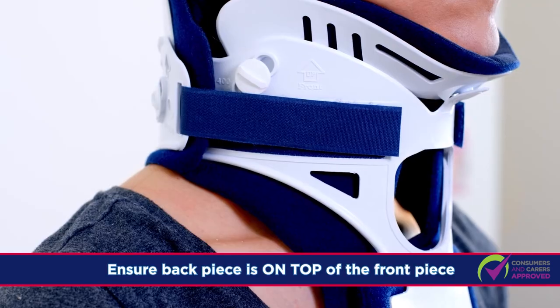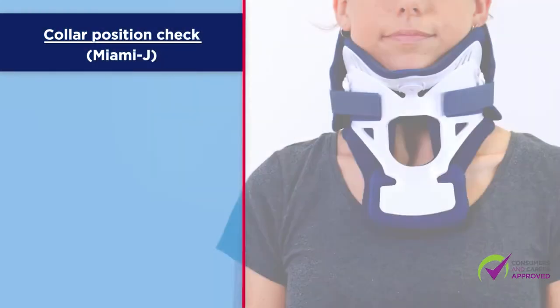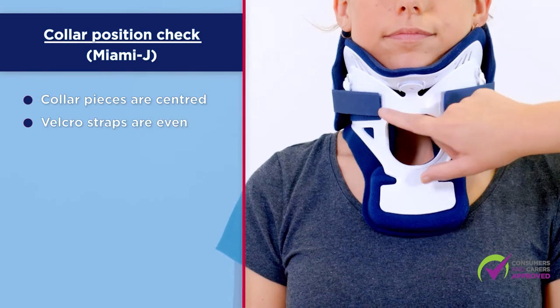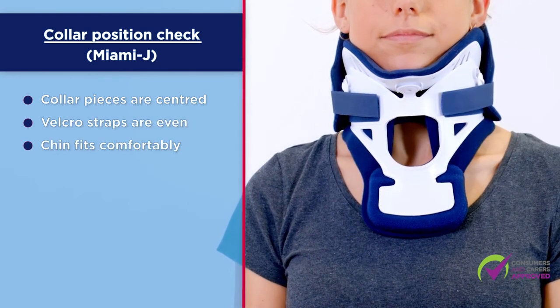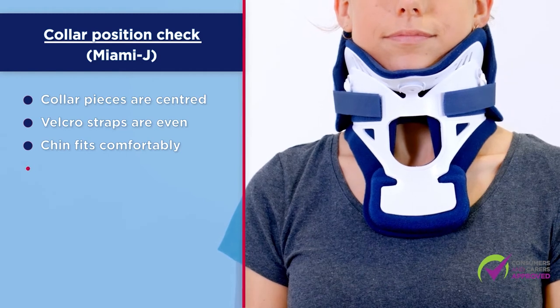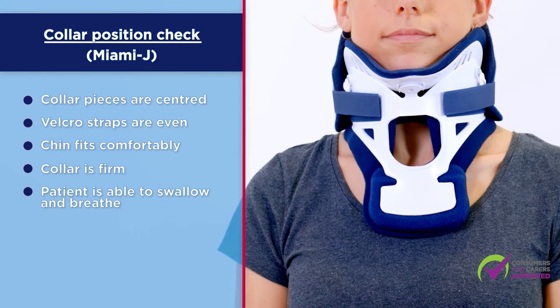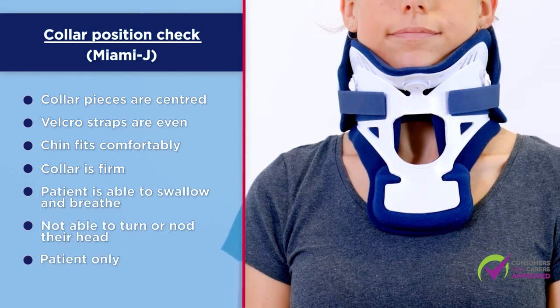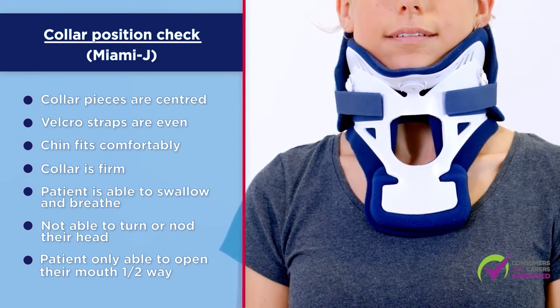Make sure that the back piece sits on top of the front piece. Check that the collar is correctly positioned. The collar pieces are centred. The Velcro straps are roughly even. The chin fits comfortably into the chin section of the front piece. The collar is firm. The patient should be able to swallow and breathe, but not turn or nod their head. The patient should only be able to open their mouth halfway before feeling pressure on their chin from the collar.